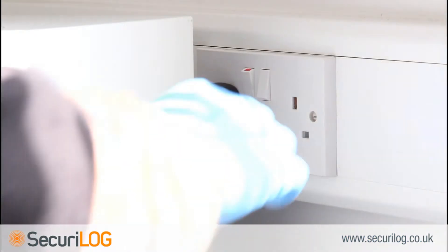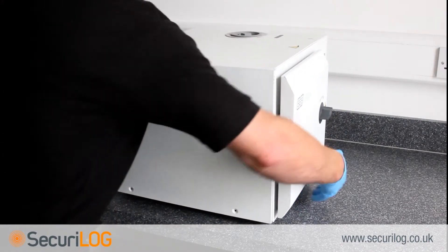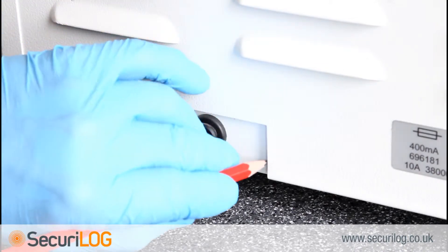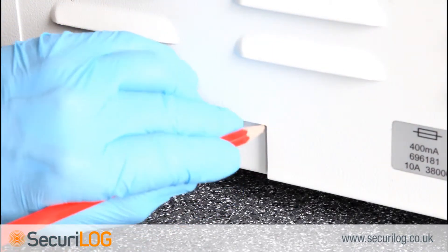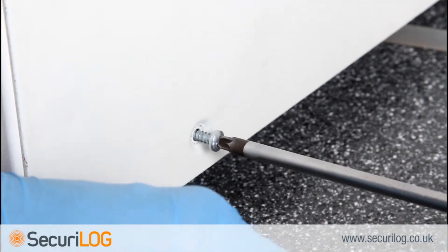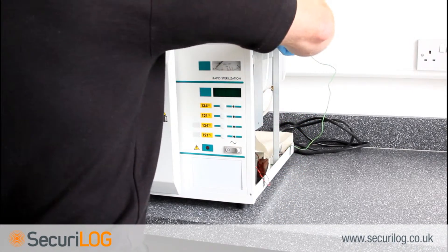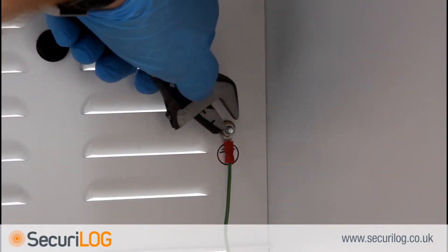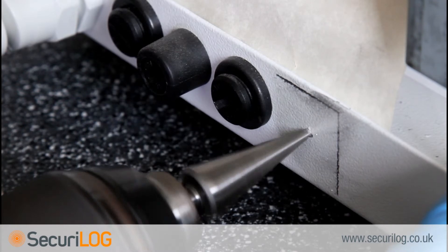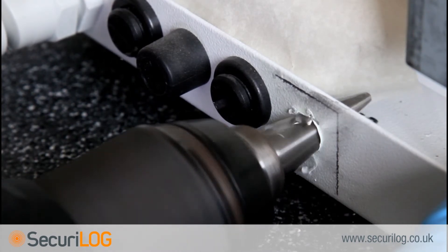Installing the bulkhead fitting: unplug the steriliser from the mains and move into a practical position. Using the cover as a guide, mark where the hole will be drilled. Unscrew the cover fixing screws and remove the cover, taking care not to damage the earth cable which also needs to be removed. Drill a hole 11.5mm in diameter to the right of the fuse holders — this is the only location which will allow the cover to be replaced after installation.